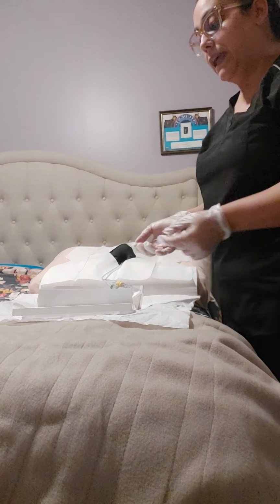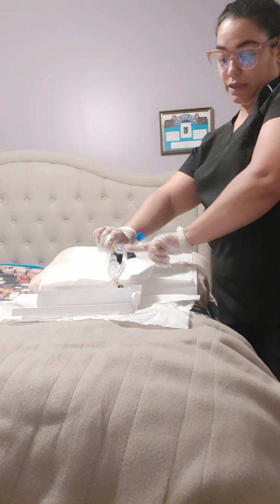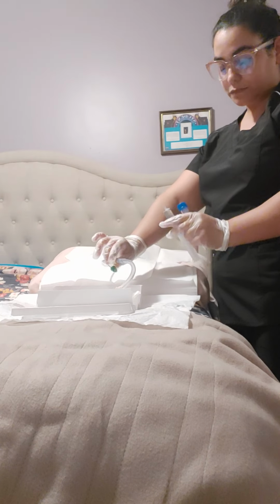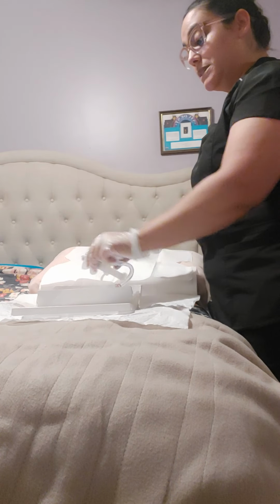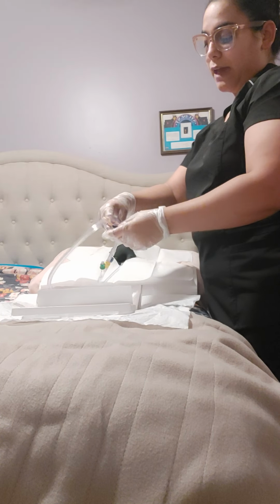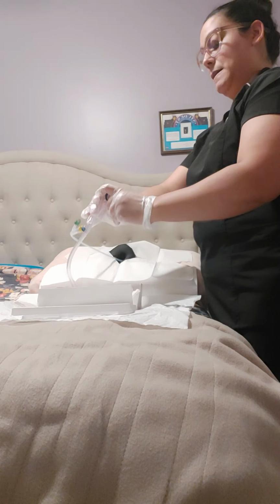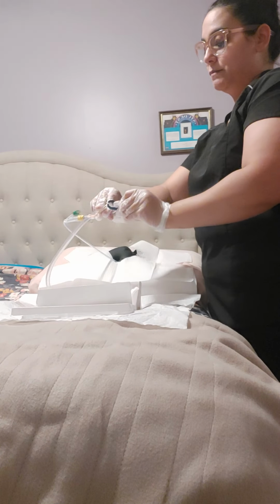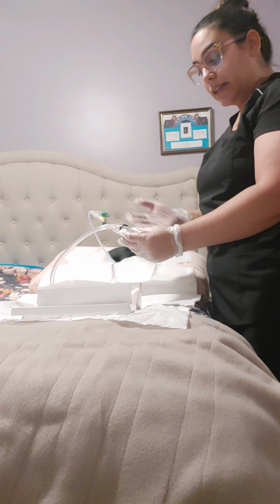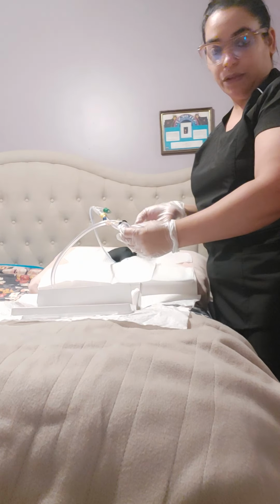Now, if I needed to get a sterile urine specimen at this point in time, I would use the port to get any urine samples. And if for some reason there is no urine in the actual catheter, you can just kink the catheter like so. We have this nifty little clamp here that you just put around it like this, and you would just wait for it to collect urine, and once it collects the urine in the actual catheter, then you would be able to use your port to get the urine sample.